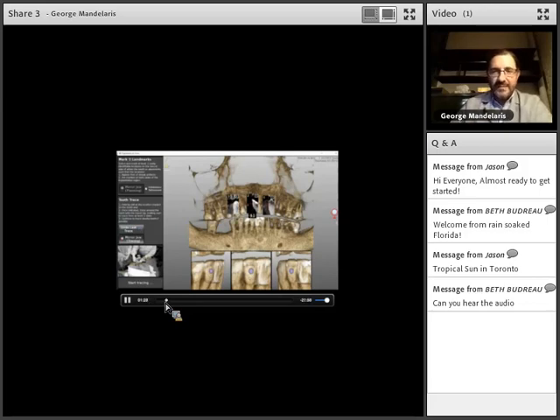You can see that, again, contact mapping. She's moving the tooth around. And it doesn't just have to be that tooth. It can be adjacent teeth as well, directly adjacent to that tooth. Basically, you want to get 100 points that have been mapped by contact. So here's the third and final tooth. Again, today we try to do 4 landmarks rather than 3.